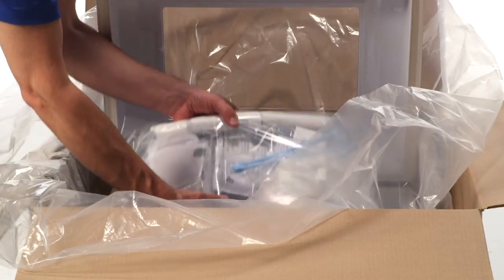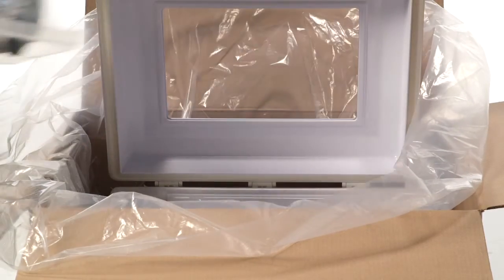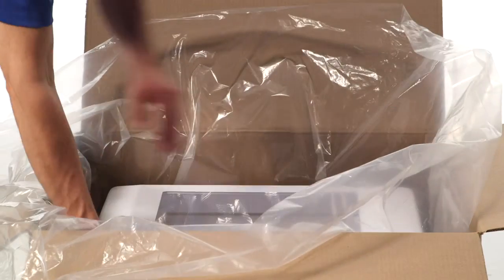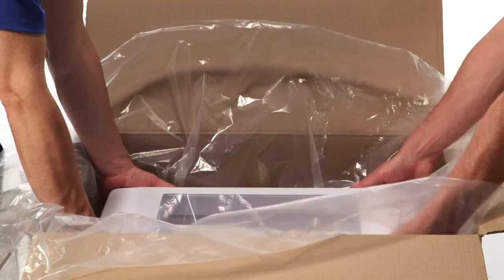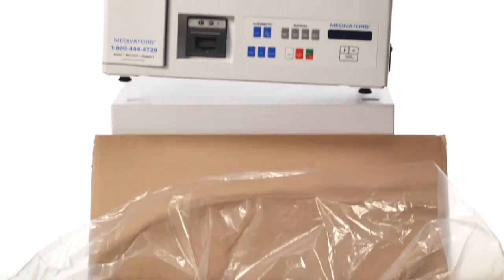After opening the CER box, removing the installation kit will make it lighter to lift out the unit. There are numerous installation scenarios, but for the CER disinfector, let's discuss countertop and cart installations. For countertop installation, the connection hoses can hang over the side and back of the counter, or they can go through the counter.